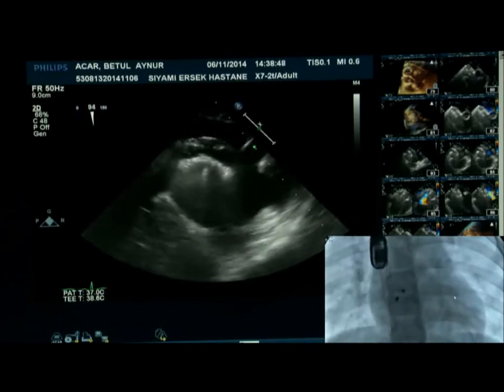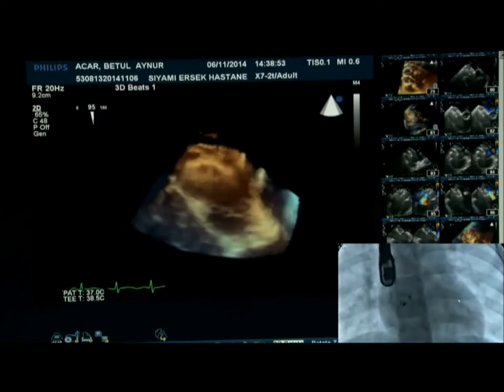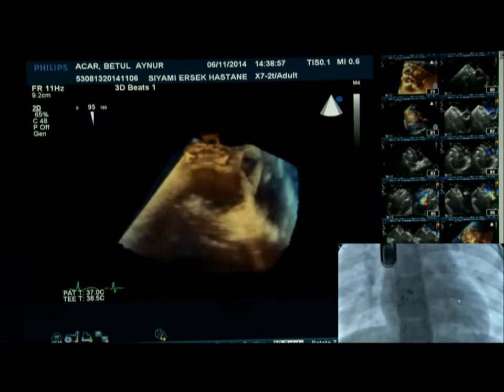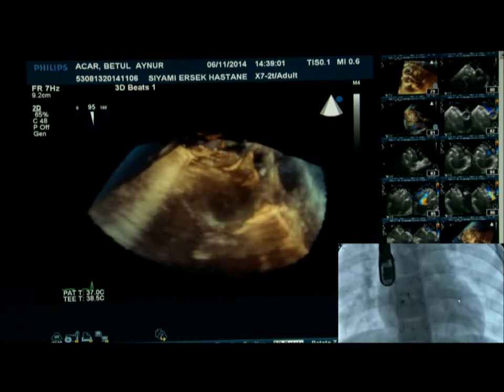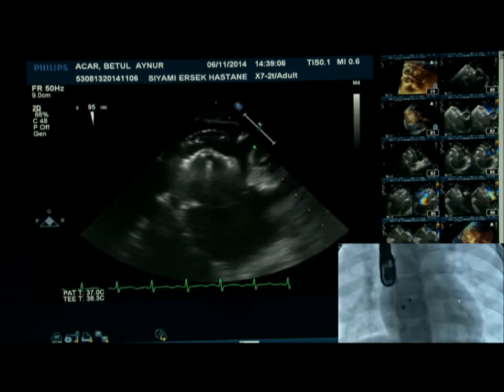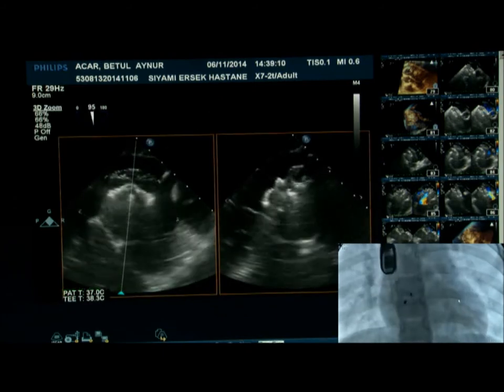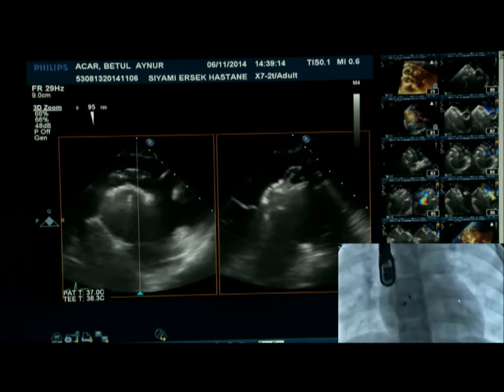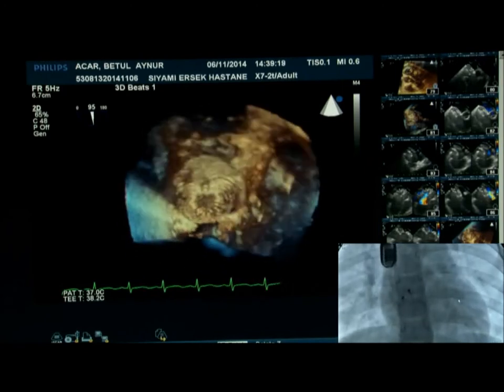Since the patient has aneurysmatic septum, could it be a better selection instead of a regular device, LifeTech or Occlutech, where before releasing the device, we could see easily the position of the device safely? What do you think about this? Right. Can you say that again with a better microphone? What was the question or comment? The question was whether you would use another device because of the aneurysm, a LifeTech device or Occlutech. Okay, but it's the same.